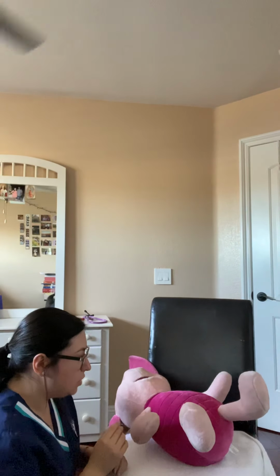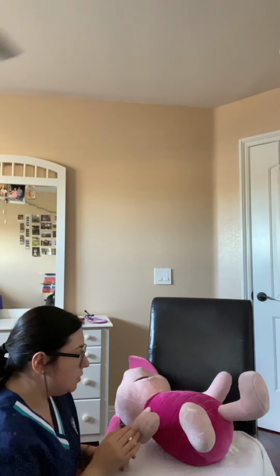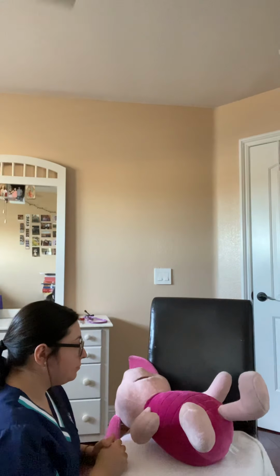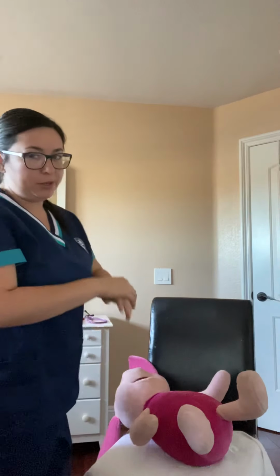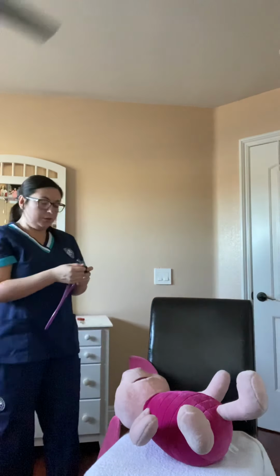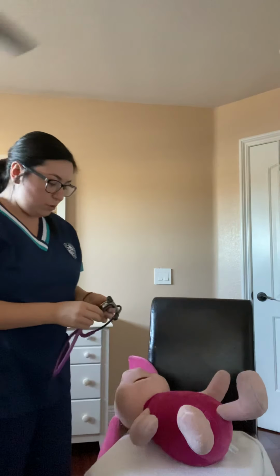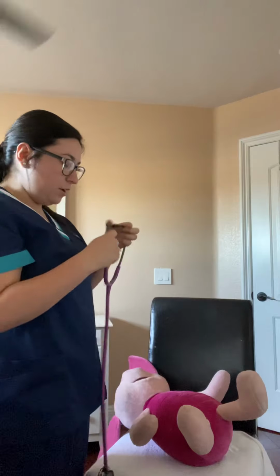The contour of the stomach is rounded, a little bit rounded. And now I'm going to be auscultating. So I'm going to go ahead and hand sanitize. I'm also going to sanitize my stethoscope. For auscultation of the quadrants, I'm going to be using the diaphragm on my stethoscope.